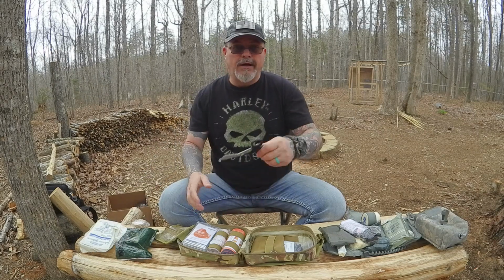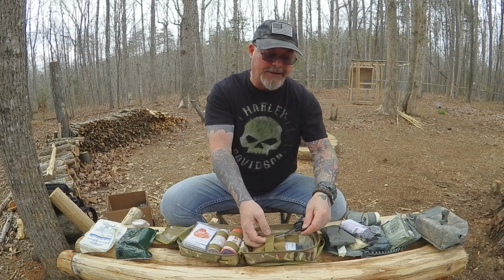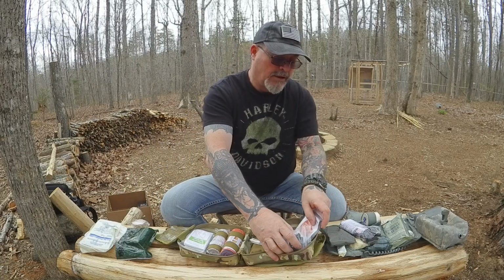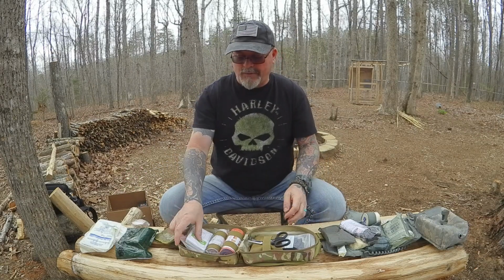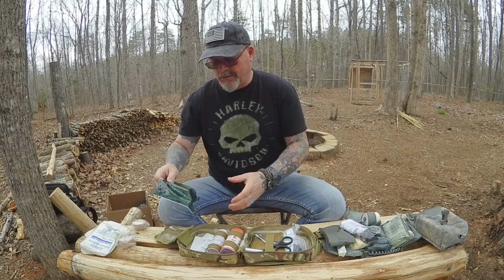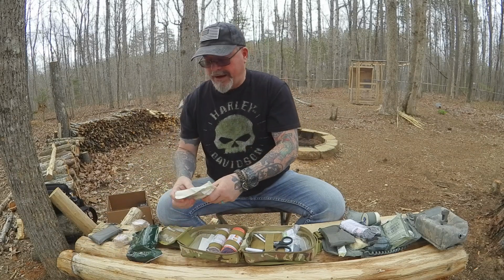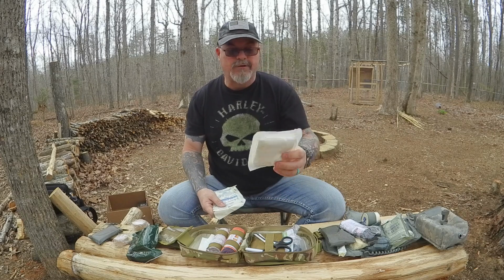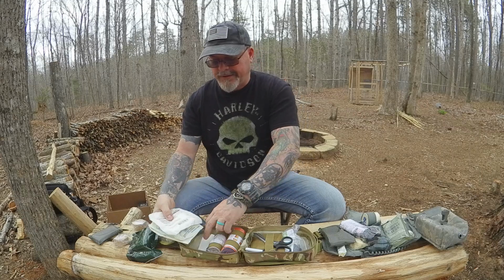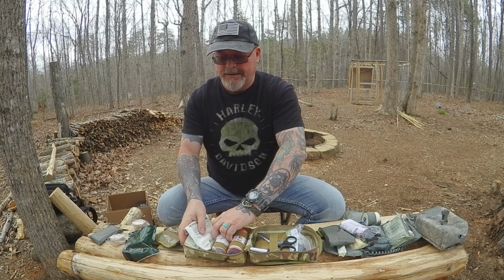So you can upgrade your shears later on. You can upgrade your bandages later on as you use your bandages. You can add some more bandages like I have in this kit, where I added a few things that I felt I wanted to have in there, a little bit more than what was in this kit. So I have a few extra things, like this gauze wrap. I've got some bigger gauze pads in this kit that I felt were necessary to have for me.